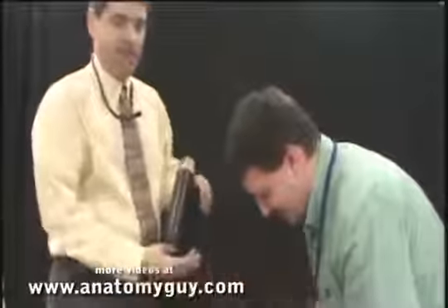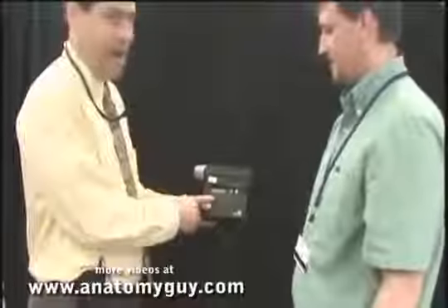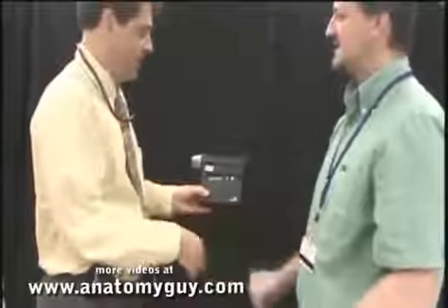Blow, blow, keep on going, more, more, keep going. The machine will beep when he's done. Keep going, that's it. If you notice, this is effort dependent. The machine automatically will tell if there's poor effort or if there's a cough. This one, he did a good job, congratulations.